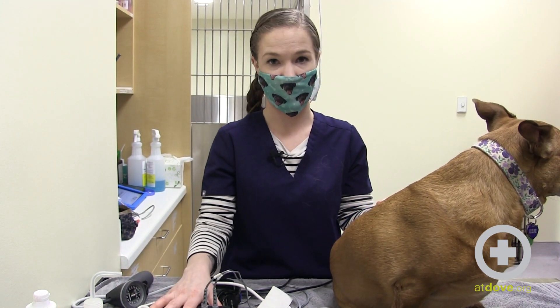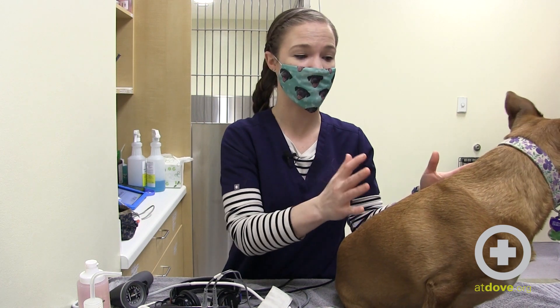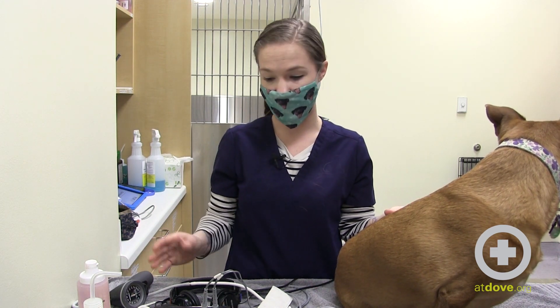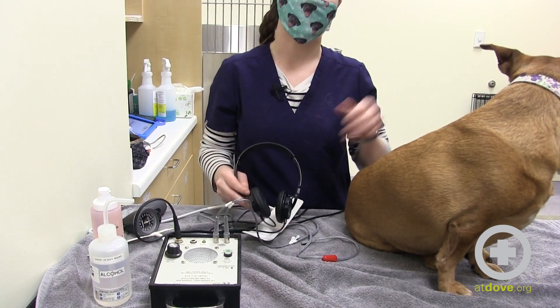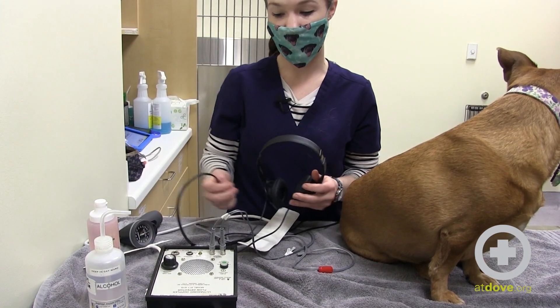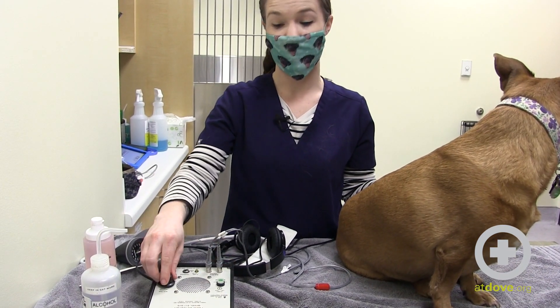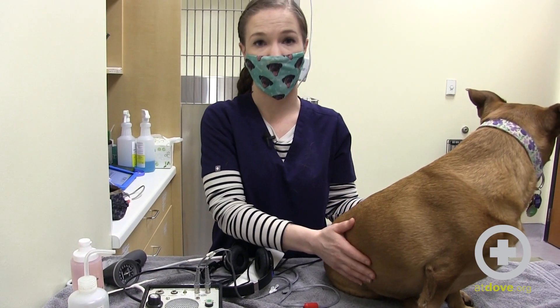Another issue is if it's really quiet. That could be an issue with some of the Doppler machines — if they're old or not taken care of properly, you'll start to get a decreased signal. If you don't have enough ultrasound gel on your crystal, that will also diminish the sound. Another factor is ambient noise. If the blood pressures are low or weak to start with, you're not going to have a really good chance to hear it. Try to minimize outside noise as much as you can — but in a busy hospital or ER, that's easier said than done. These do come with headphones, so you can plug into the headphone jack and take your blood pressure as normal. You can also use your stethoscope by putting the earpiece right on the speaker — but start with the volume all the way down or you will blow out your eardrums.